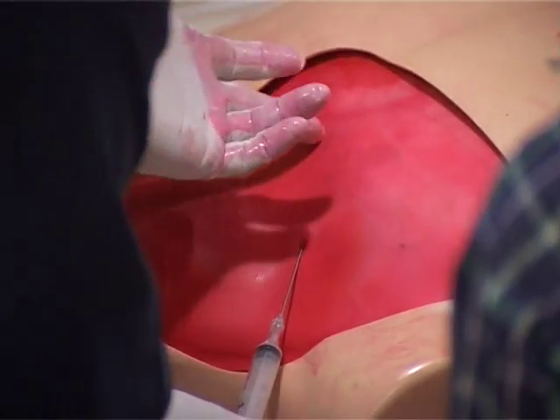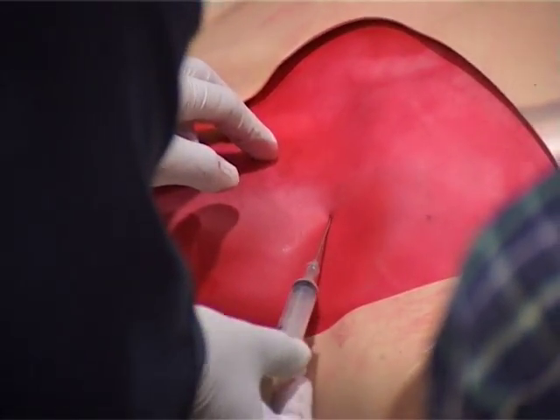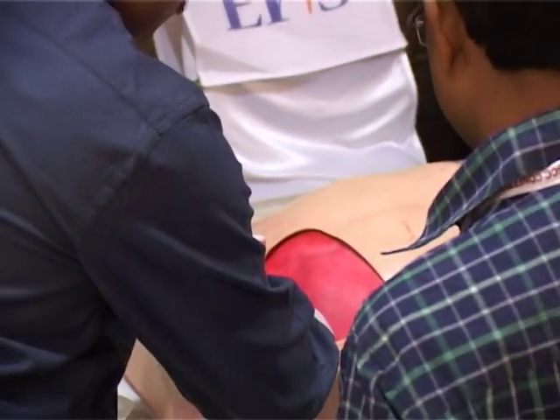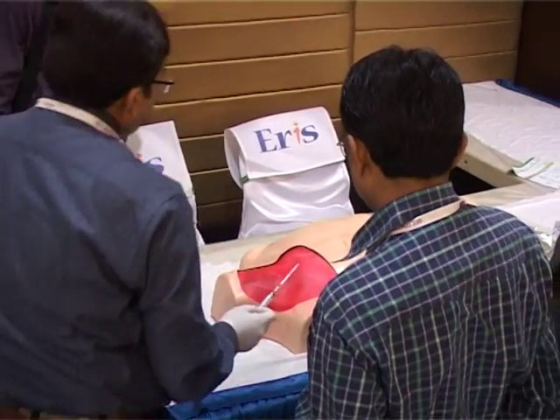First go towards the suprasternal notch. This is your posterior triangle approach. Okay?